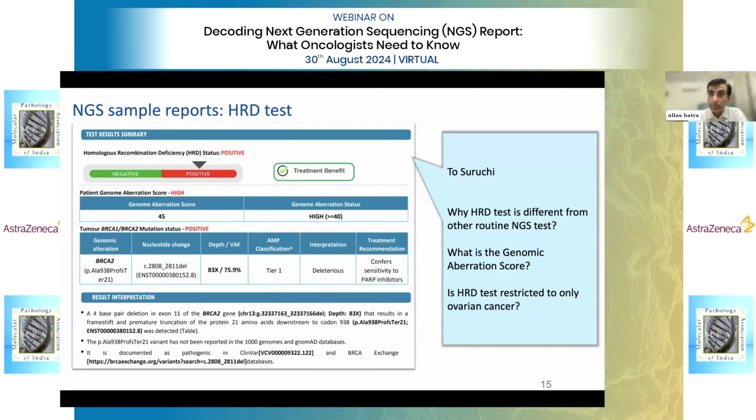We have designed the assay using 46,000 SNPs across the genome. So the optimization that we have got is around 40. It depends on how we validate our assay. It is not absolute. The difference in the score cutoffs doesn't determine whether the HRD assay is comparable to Myriad or not.